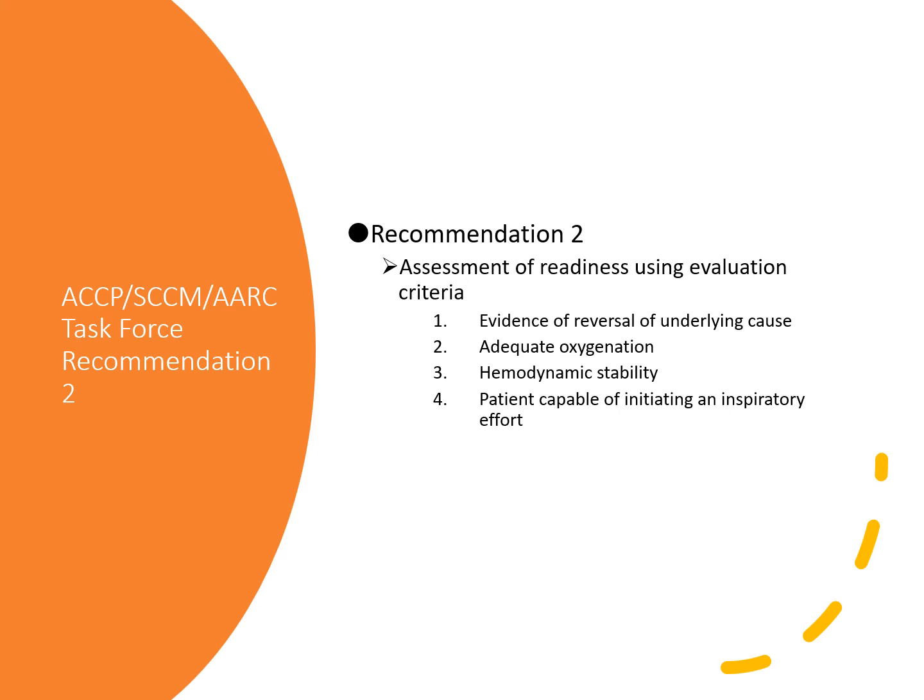Is the patient capable of breathing in on their own? Do they trigger the ventilator? So we should look at that as well. So your assessment techniques will come in pretty handy here.